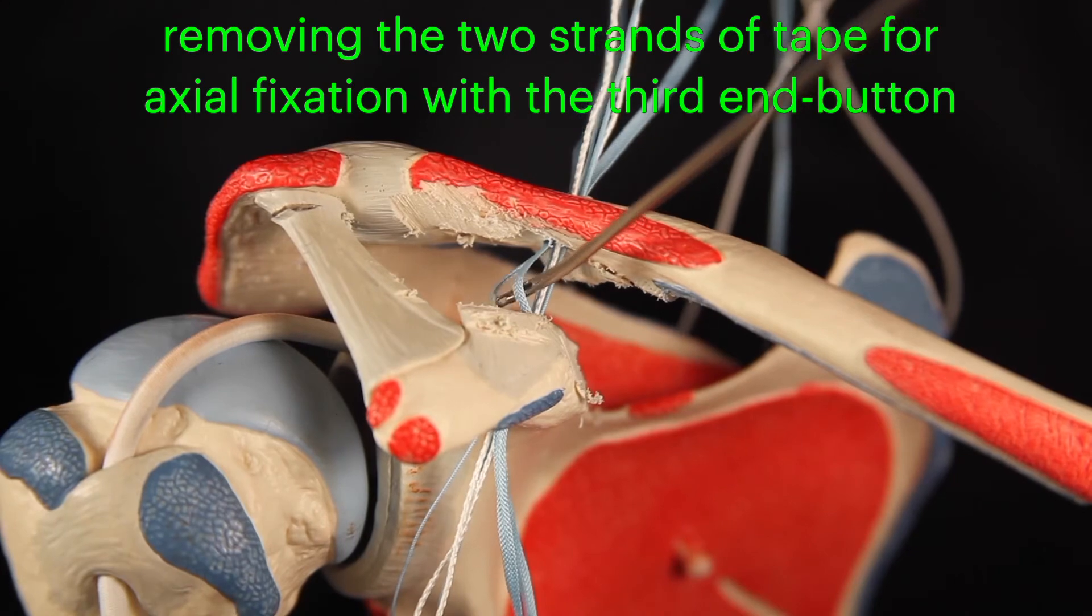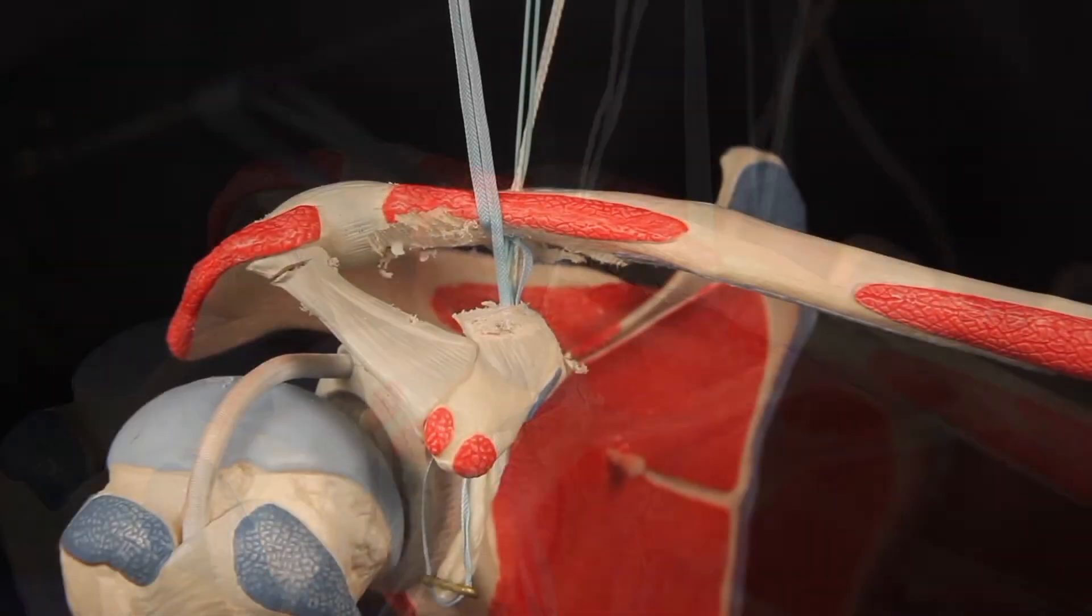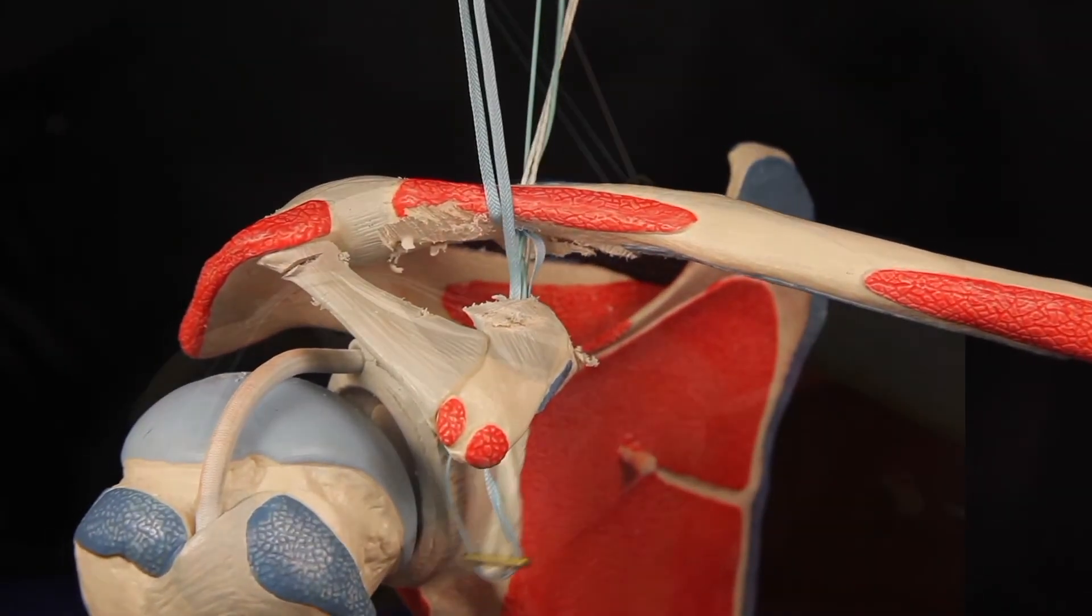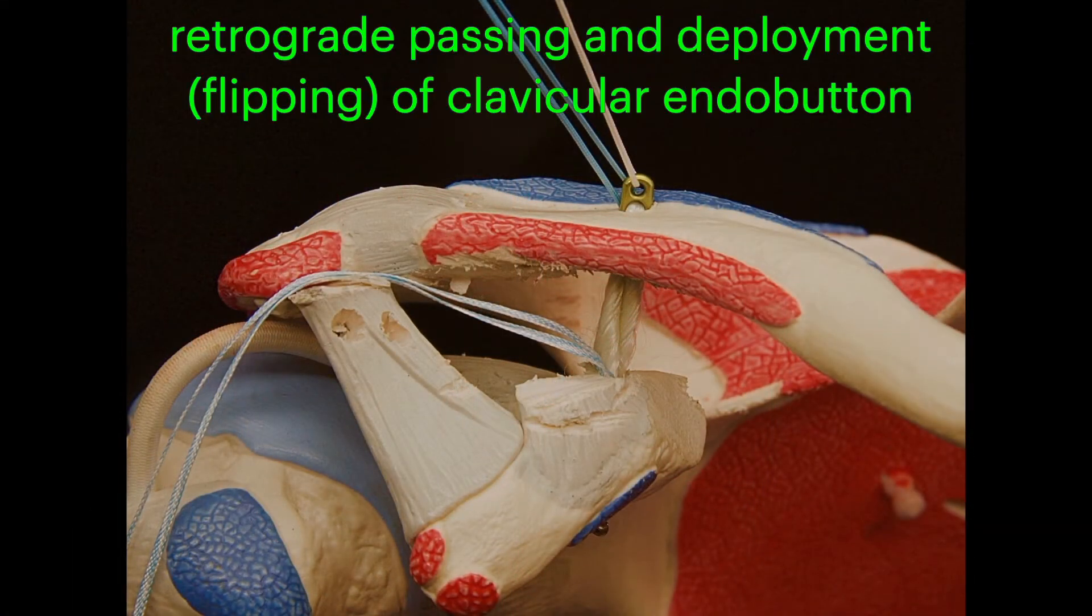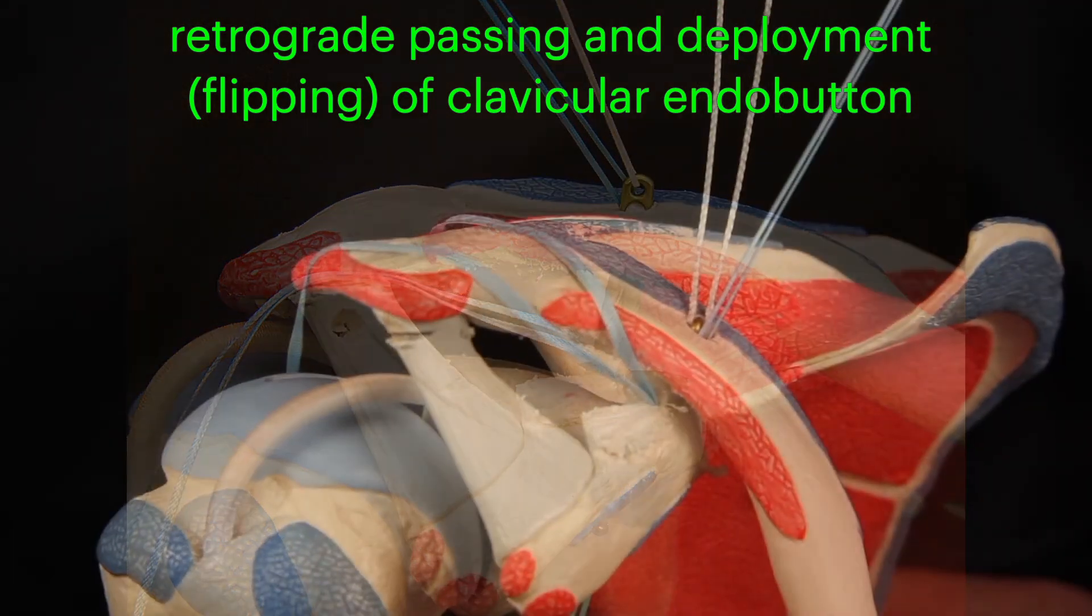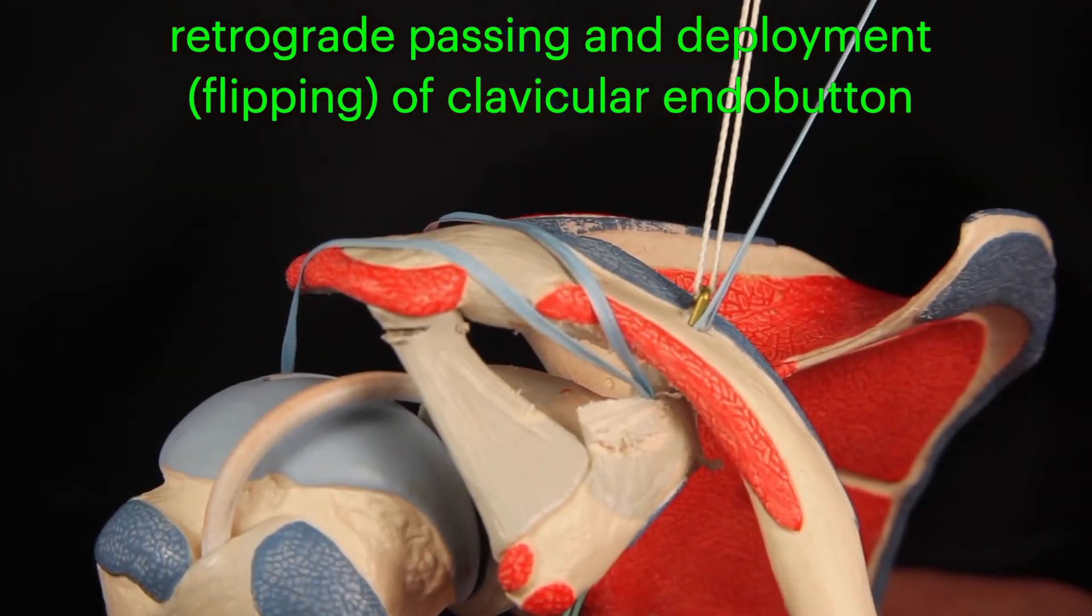The two ultra tape limbs are then pulled out of the coracoid clavicular space with a probe. By pulling on all six limbs, the endobutton is then passed retrograde through the coracoid and clavicle and then flipped onto the surface of the clavicle, completing the fixation.